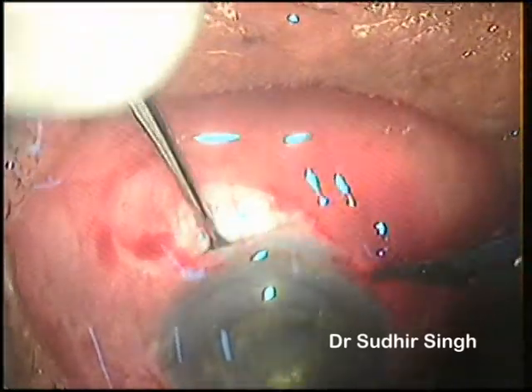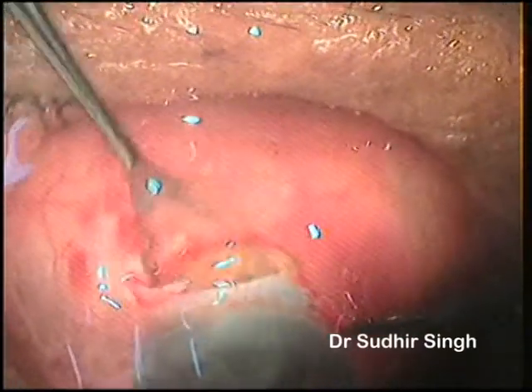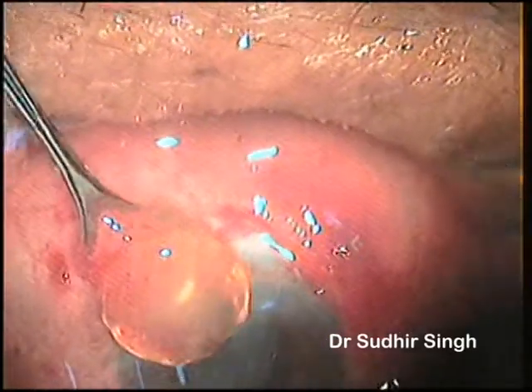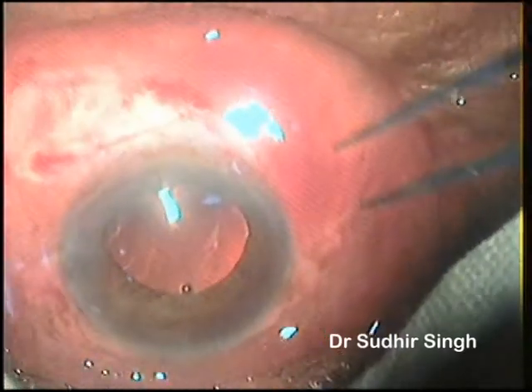The vectis is introduced by pressing the posterior lip of the tunnel, and the nucleus is taken in the lap. Then the vectis is taken out along the nucleus while simultaneously keeping the posterior lip pressed. The cortical matter is cleaned and a 6 mm PMMA intraocular lens is implanted.